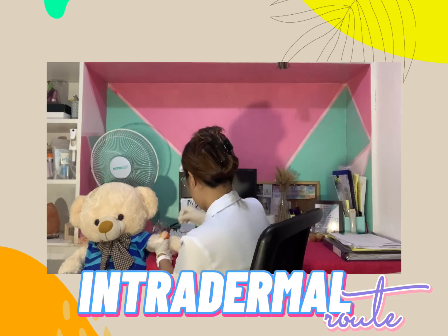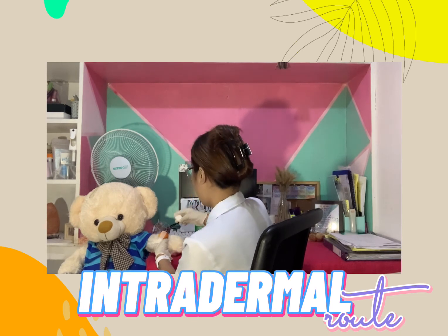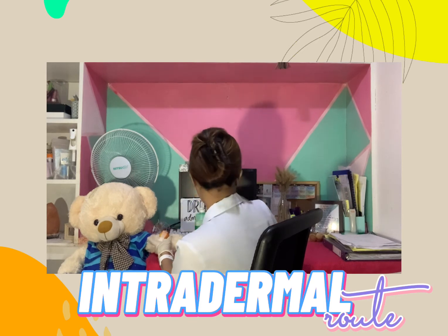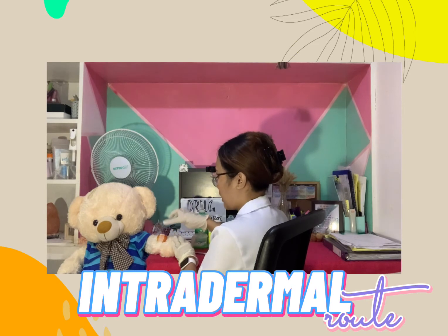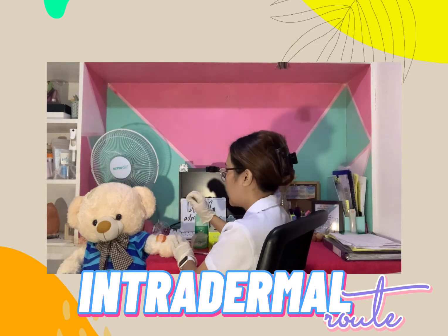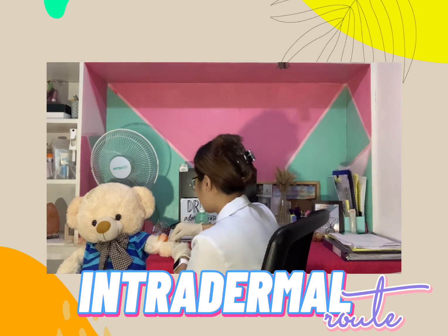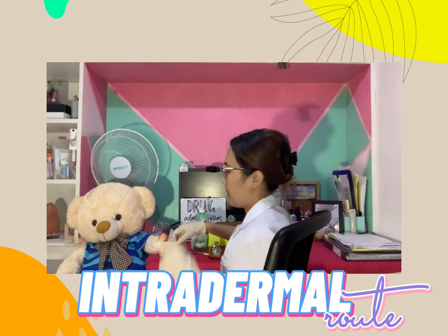After assessing the area, we can start disinfecting it by the use of cotton balls and alcohol, starting from the inner corner going outwards. And then we need to make sure to discard the cotton ball, and then we need to make sure to let the area dry. After that, we can now start the administration of the skin test to the patient.